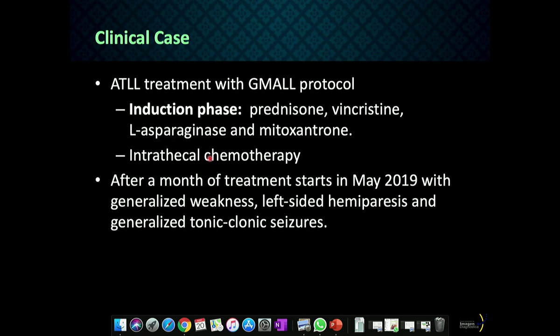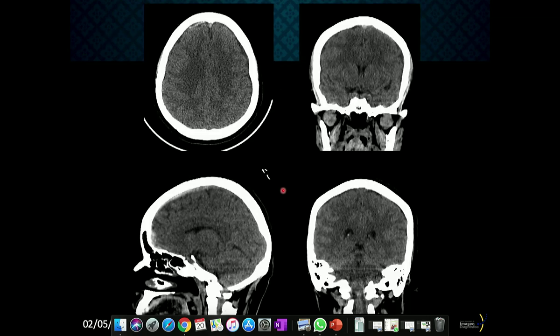After a month of receiving this induction phase therapy, she started in May 2019 with generalized weakness, left-sided hemiparesis, and generalized tonic-clonic seizures. Because of this, a head CT was done. Here are the most representative images of the study.